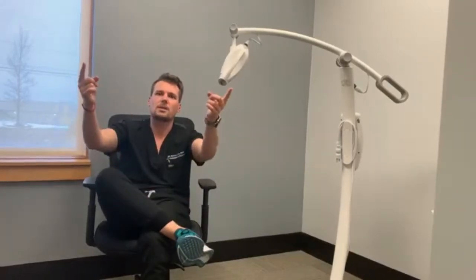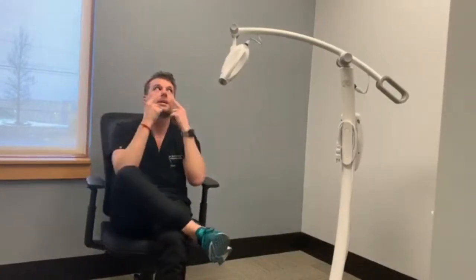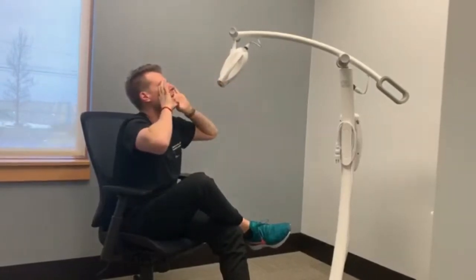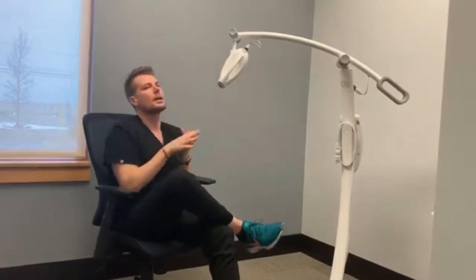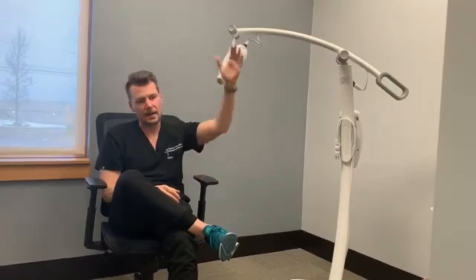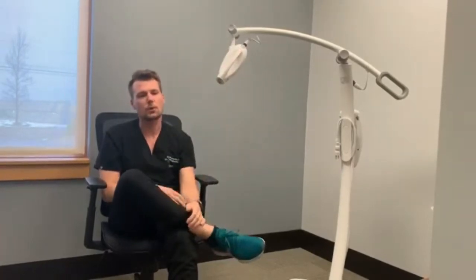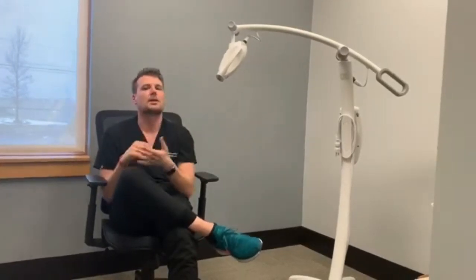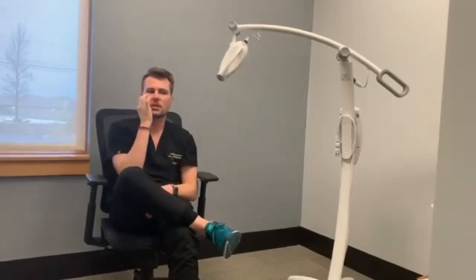Once that's activated, we take the light, which fixes to a ring we've assembled, and start your first session. The first session is 15 minutes, and we always start at the highest setting. The hygienist will be with you the whole time — you can communicate with them via a notepad, for example to ask them to suction your saliva. After the 15 minutes, we suction off the bleaching component and make sure you're comfortable.